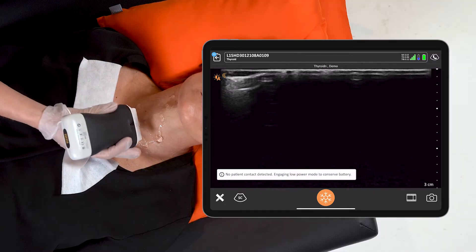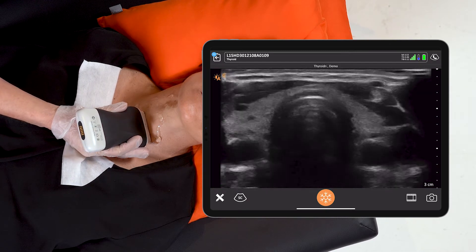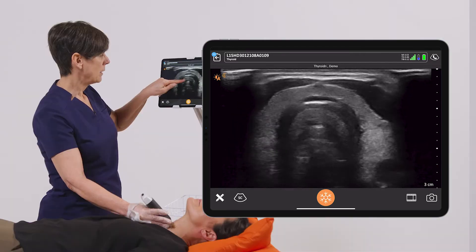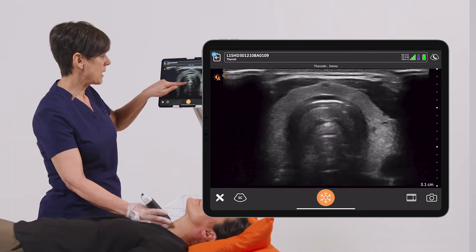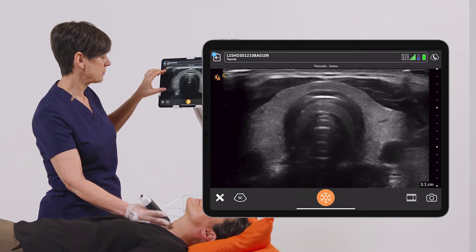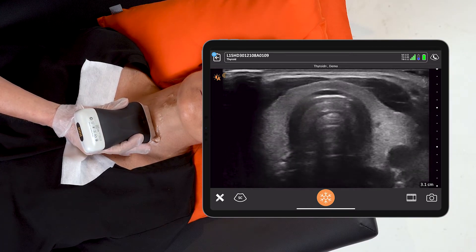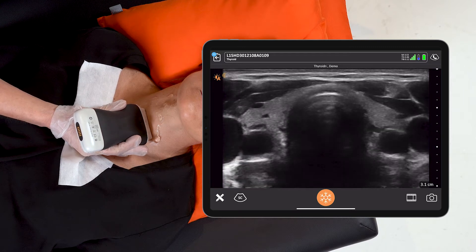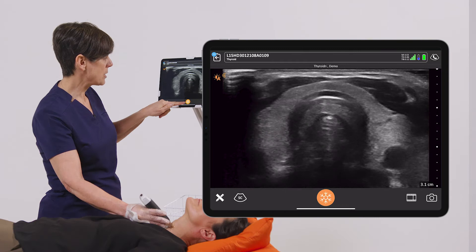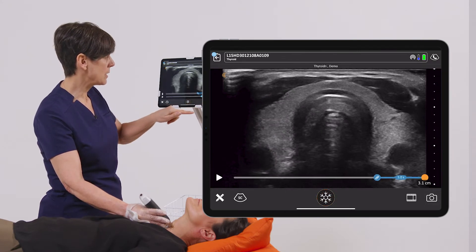I like to start midline on the patient's neck so that we can get a really nice view of the isthmus of the thyroid. From here I can increase or decrease my depth to make sure that I'm including the entire gland. I'm going to sweep from upper to lower through the isthmus. When I'm happy and not seeing any abnormalities, or I just want to document normal, I'm going to freeze the image and take a picture.